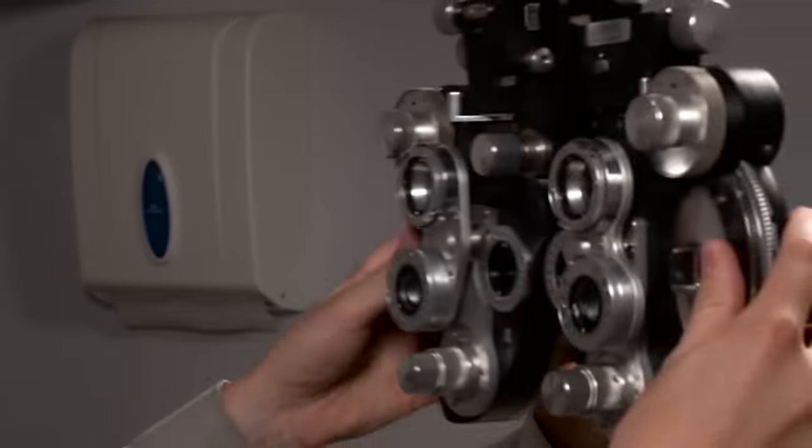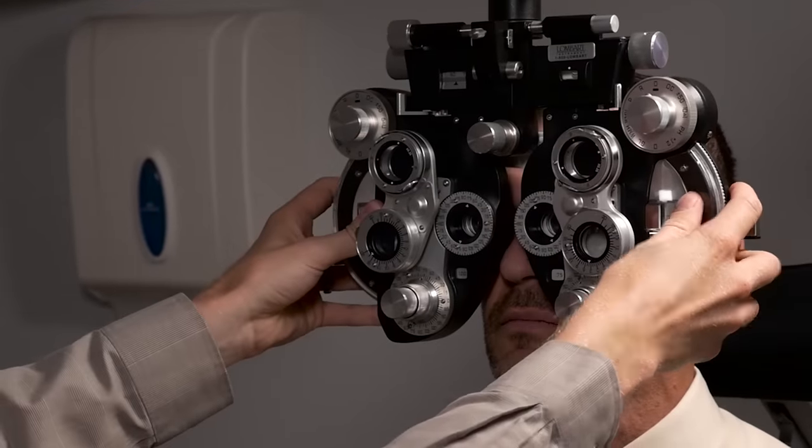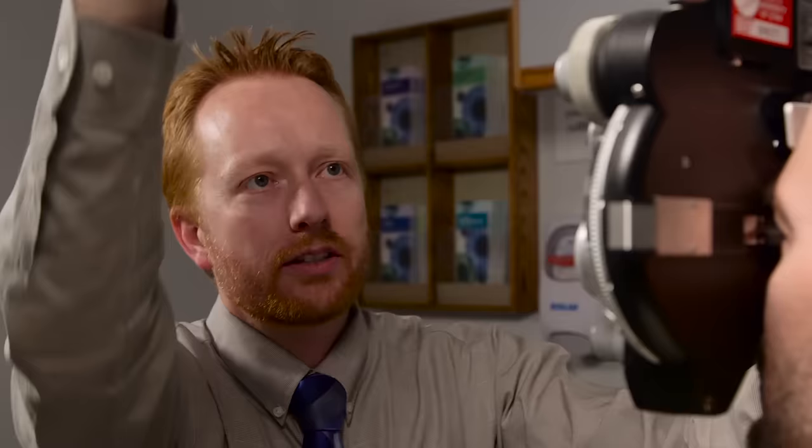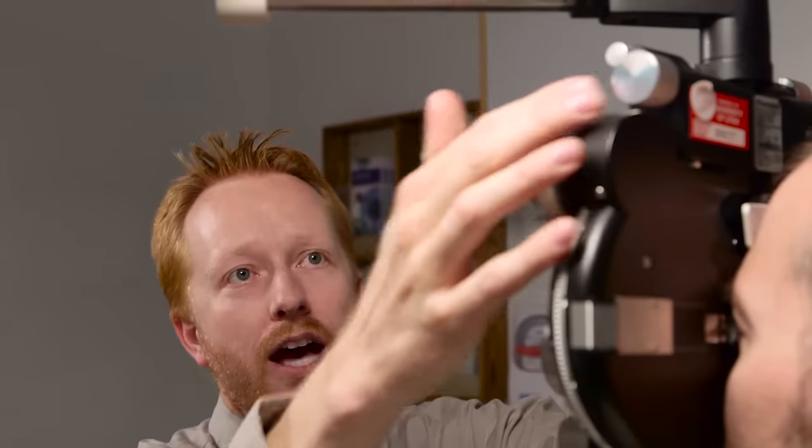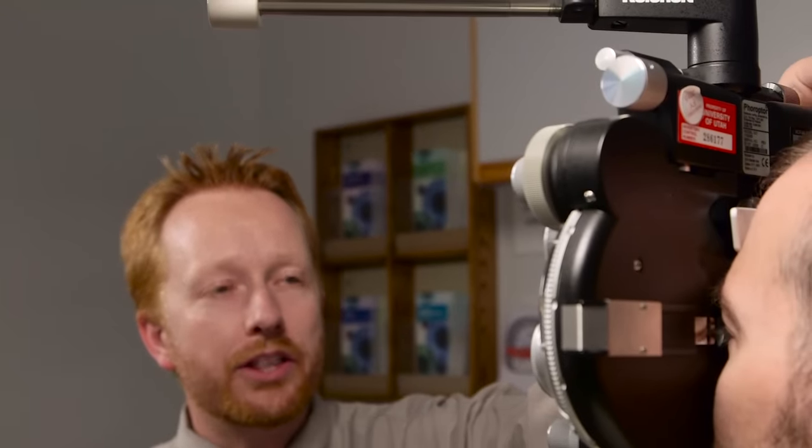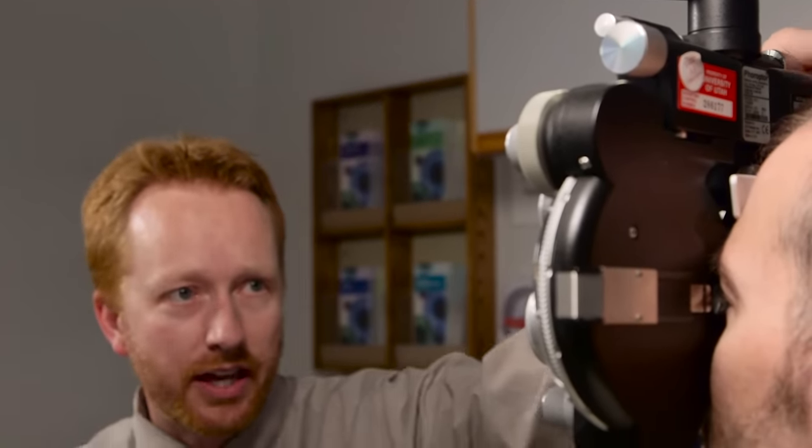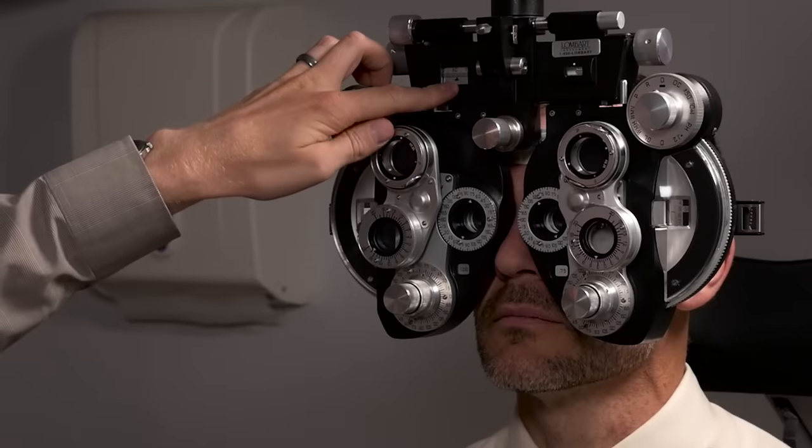To begin the exam will start with calculating a glasses prescription. We're going to start by putting the phoropter in front of the patient and what's really important is first of all to make sure that the pupil distance in the phoropter matches the pupil distance of the patient. There's this knob here at the top that adjusts whether the pupil distance is smaller or larger. In this case this patient has a pupil distance of 62 and so I'm going to set it up here at this indicator line at 62.